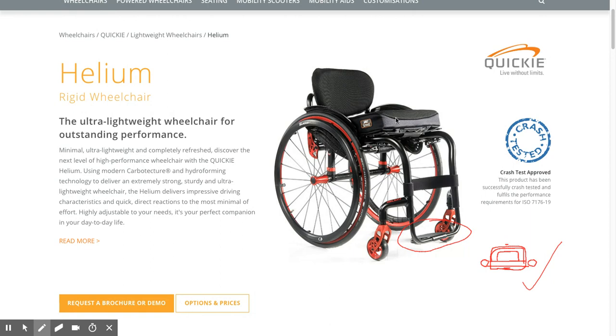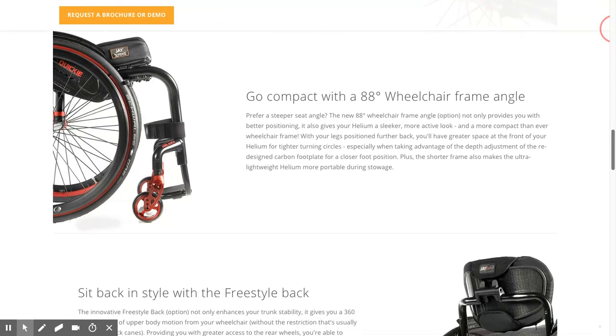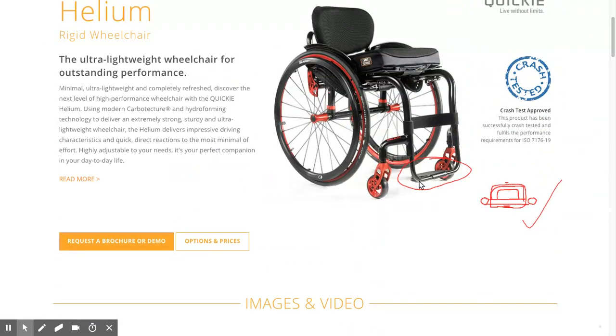Some Helium chairs have a plate-type footrest. As you can see from that photo, you've got this D-section and a clip-on carbon or plastic plate.